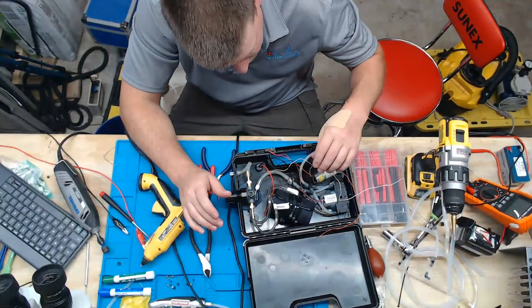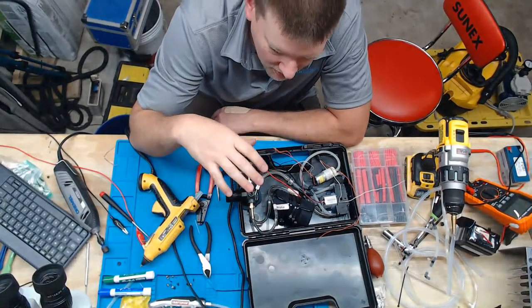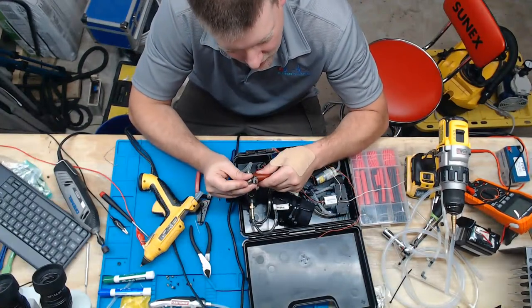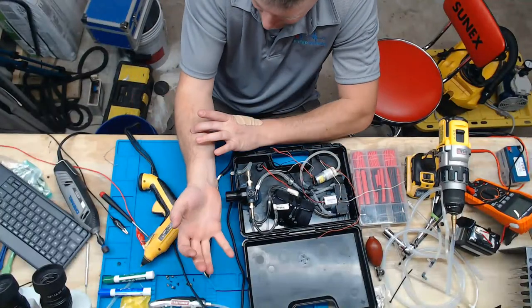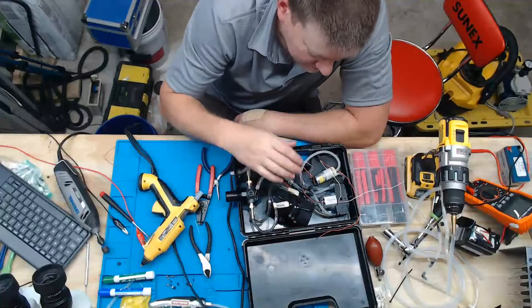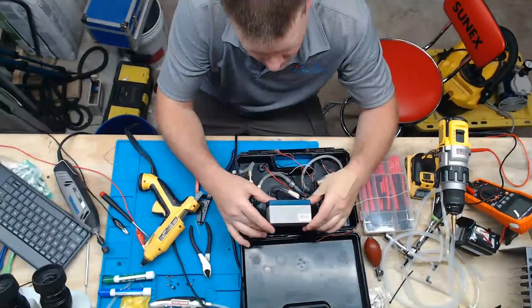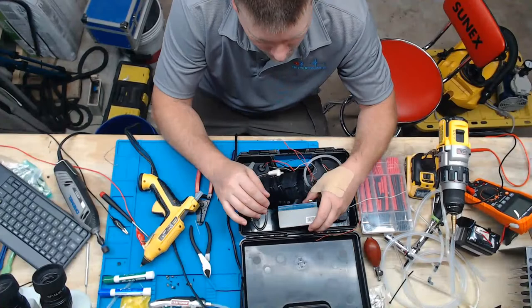So guys, this is going to be quite the cool little thing. And I have been thinking about this for a long time because when we're doing pneumatic tourniquets, you're sitting there squeezing the heck out of this little bulb, this guy right here, and once you get up above like 300 millimeters of mercury, which is not that much pressure, your arm feels like it's that big. So I came up with this design, and it's basically going to have either an external battery. I wanted to put a battery inside it. So I got these little batteries. Maybe I can put them inside. Haven't completely figured it out yet.